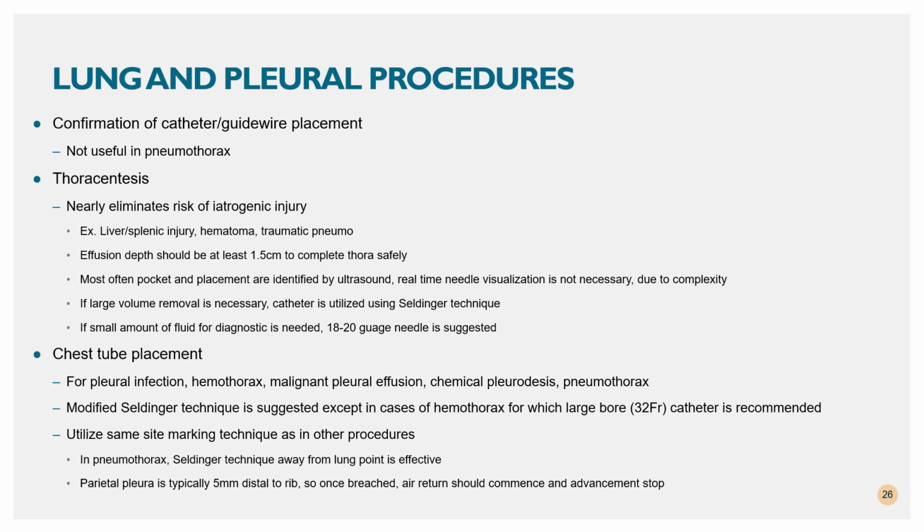Okay, so lung and pleural procedures, we're going to look at some of the individual procedures, and you guys are the experts in this, so I'm just going to, from the sonographic end, provide you with a few suggestions that they share in point of care ultrasound. We know that ultrasound can be very useful in confirmation of the catheter and guide wire placement.